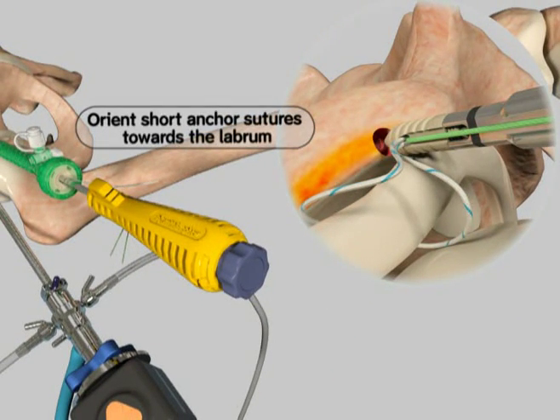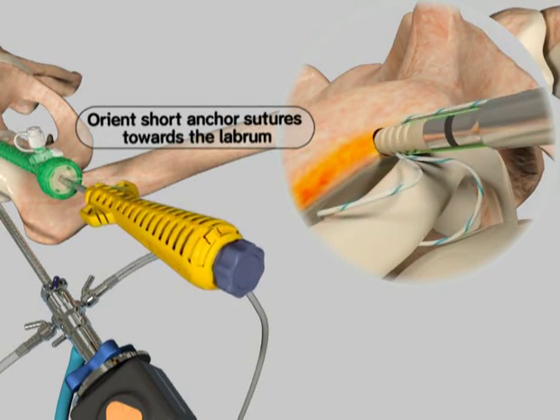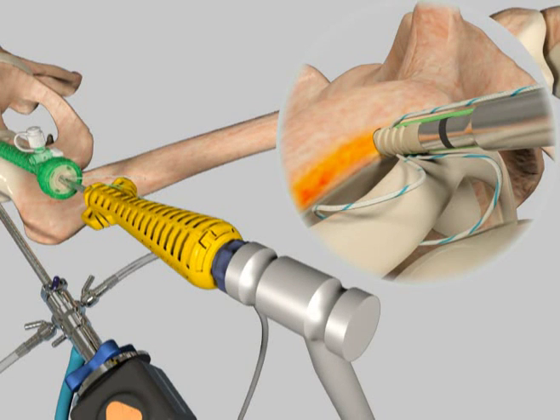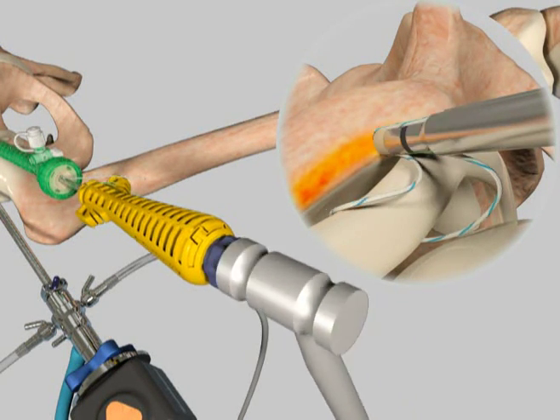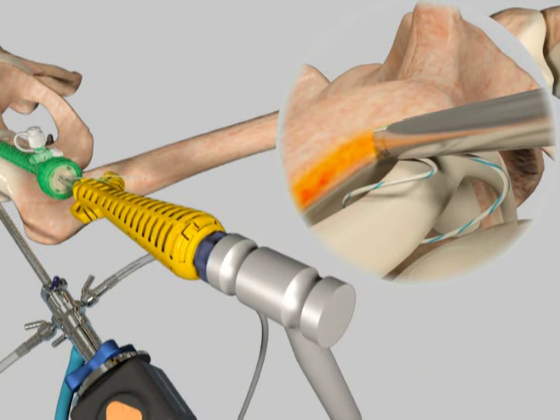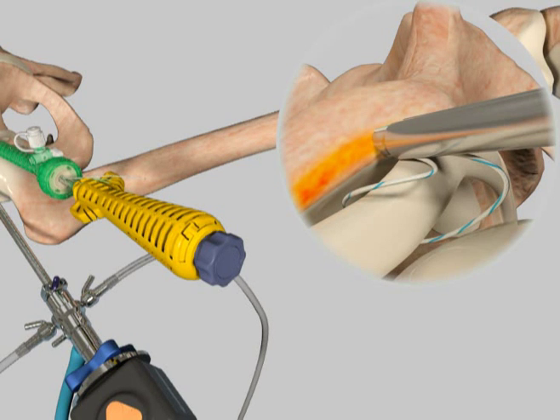Orient the anchor such that the free limb sutures entering the anchor are facing the labrum. Do not tension the suture at this time. Place the tip of the anchor into the prepared hole and tap the inserter handle with a mallet until the laser mark is flush with the cortical bone. This places the suture anchor approximately 2 to 3 millimeters below the bone surface.